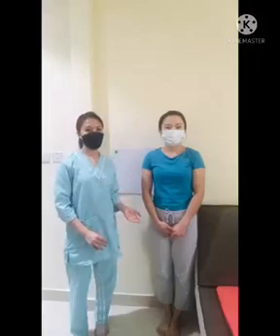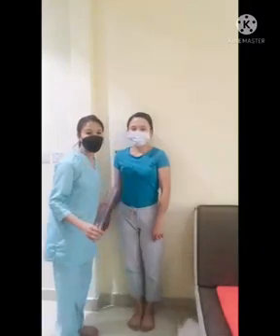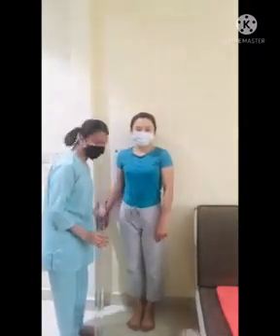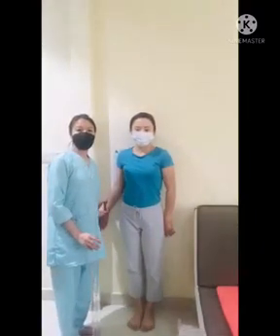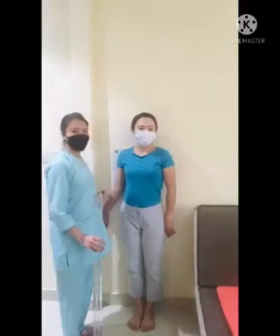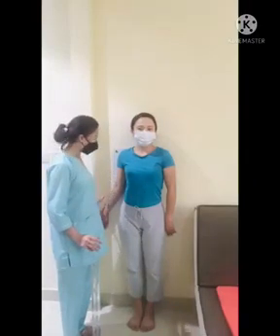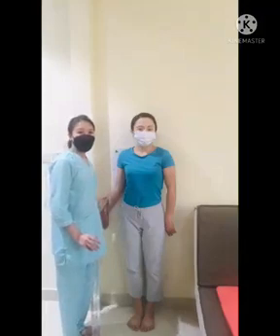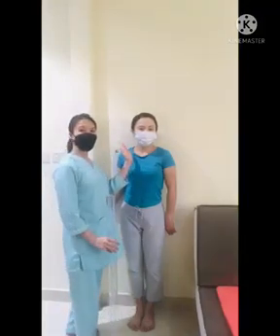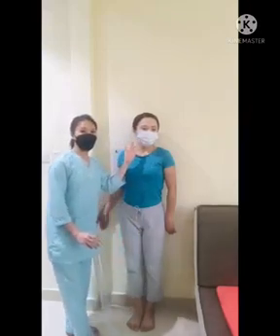Shoulder AP, which is the AP external rotation. So our patient is in standing position, horizontal to our IR. The humeral epicondyles must be placed parallel to the IR plane, with the scapulohumeral joint at the center of the image receptor. The body is slightly rotated toward our affected side. The head is turned away, so the head of our patient must be far from our radiographic image receptor.